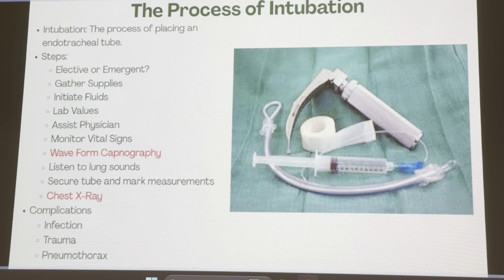One side. Went too far, right? We only went one direction. That's called a right main stem. That's going to be something you hear a lot. Usually that's what's going to happen if we go too far.